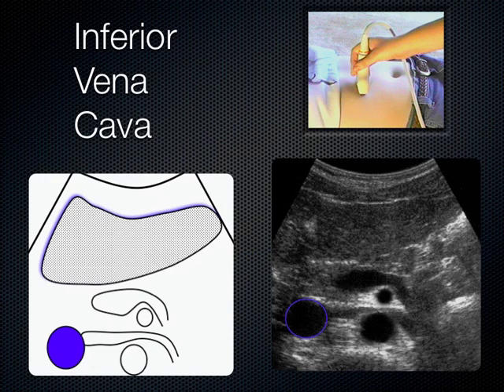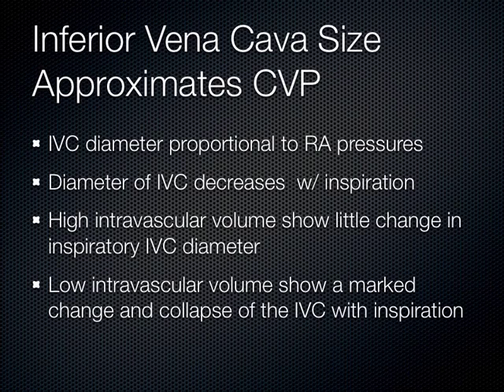Okay. One more time with the anatomy then. What's this? Good. What's this? What's this? What's crawling over SMA? Splenic vein, very good. What's this tissue out here? Pancreas. Liver. And what's getting nut cracked here? Left renal vein dumping into the IVC. Very good. Okay. Cool? Now let's talk more about the IVC. This is something that's really, really cool. I'm jumping ahead a little bit to some physiology here without getting too deep into it.